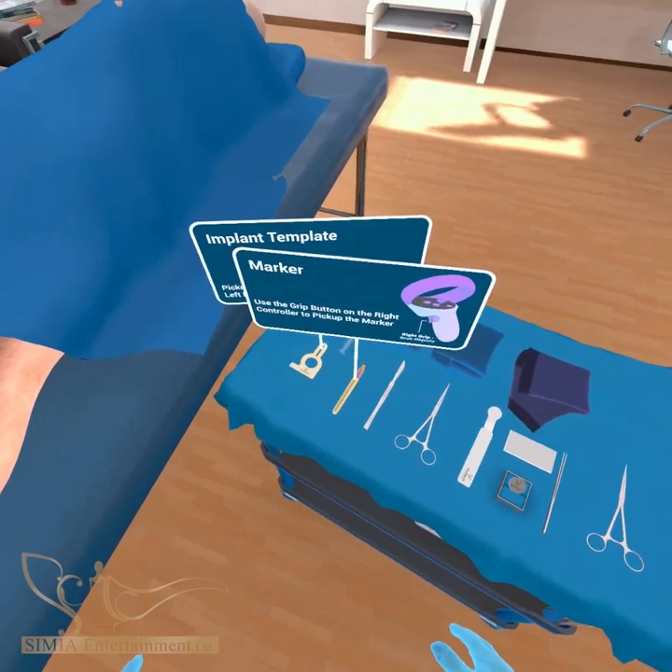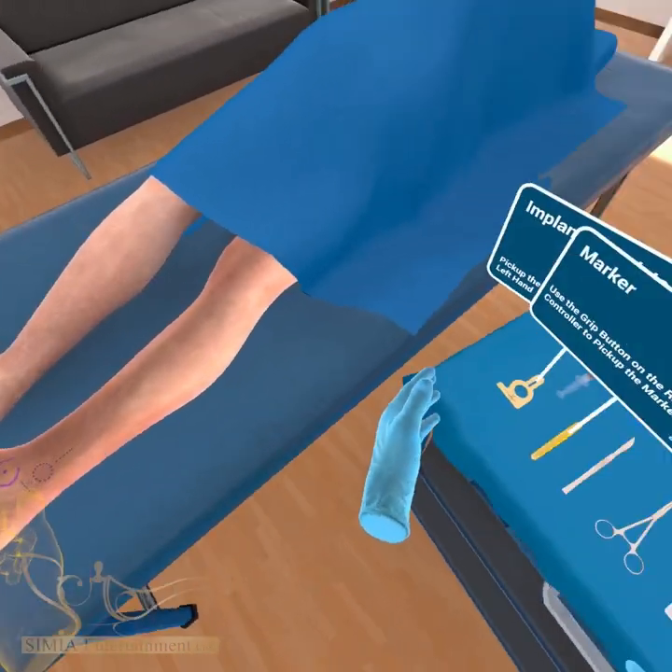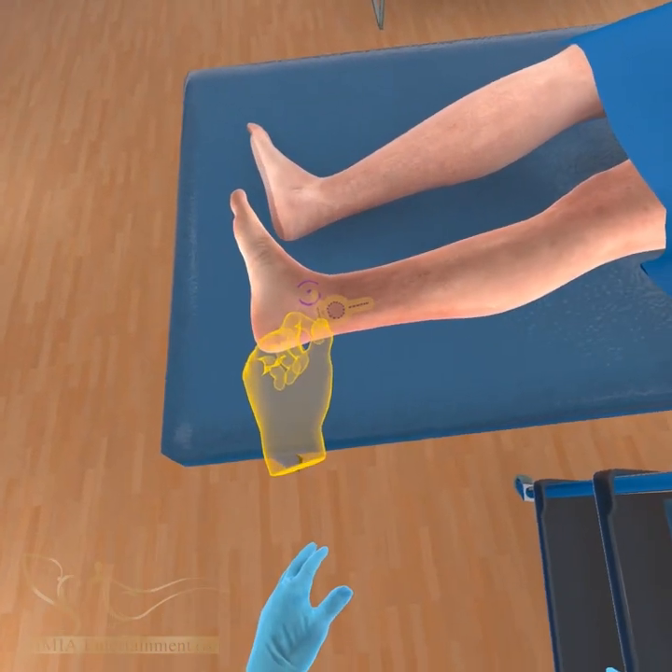Now mark the circular implant location and incision line using the ECOIN implant template.